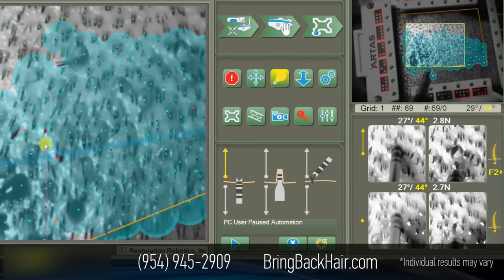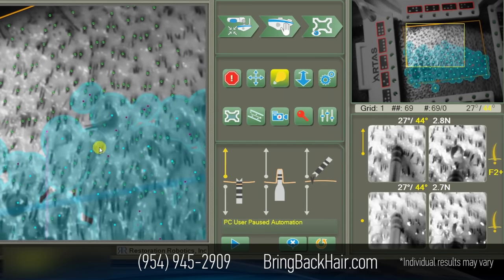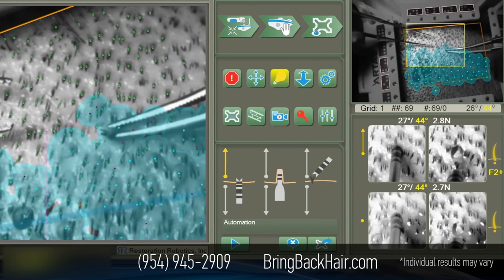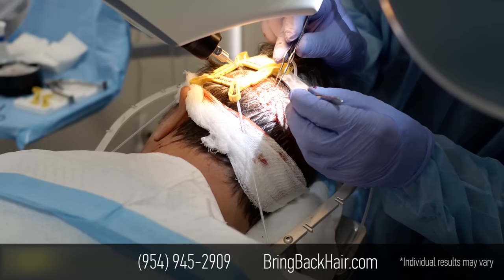We've finished about 560 grafts, and they're all looking very good. We're going to start harvesting the next set.